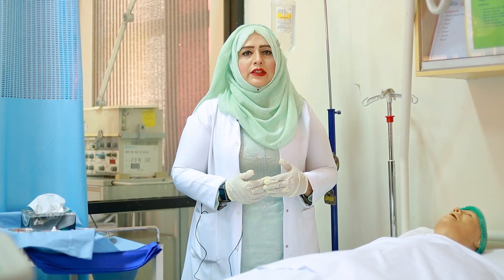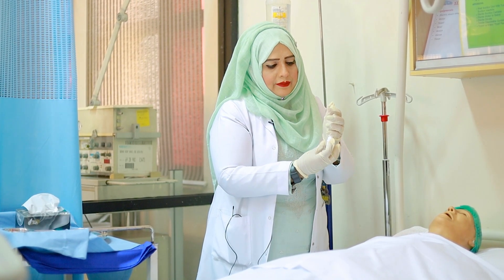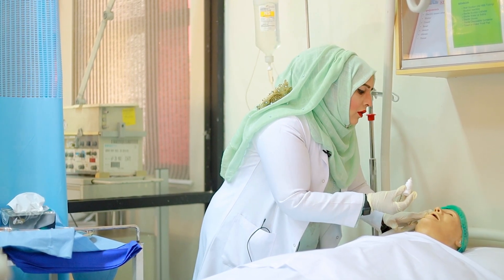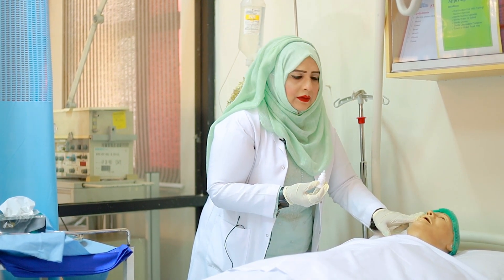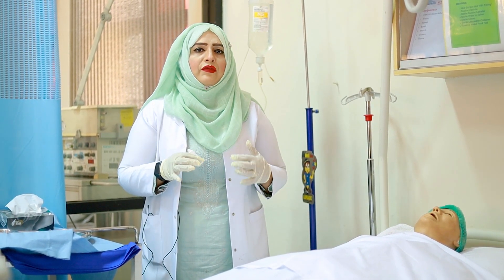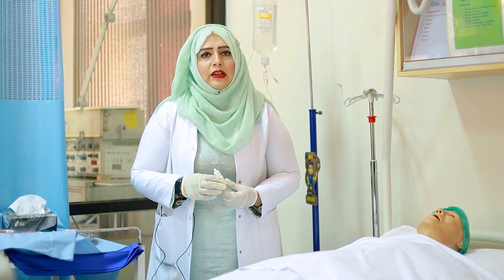As patient preparation is ready, what I will do is instill the anesthesia drops. Please avoid touching the tip of the eye drop. Please Mr. Ali, look upward, then instill the eye drops in the middle side of the eye. What is the benefit of adding these anesthesia drops? Because we irrigate when there is a chemical, and at this point the patient won't be able to open the eye. So once the anesthesia drop is administered, the patient will be able to easily open the eye.